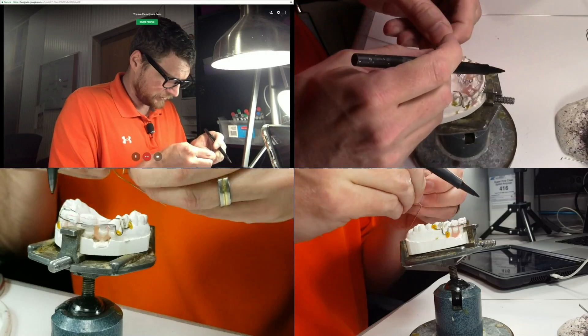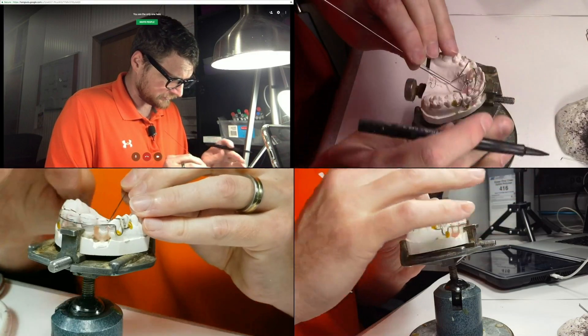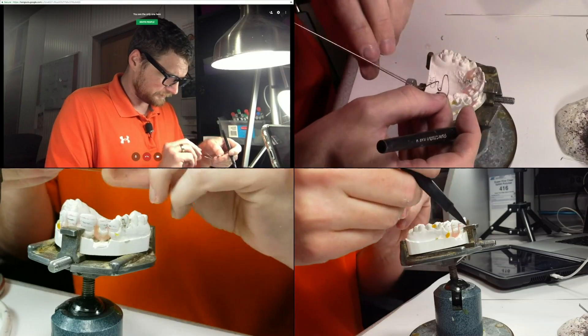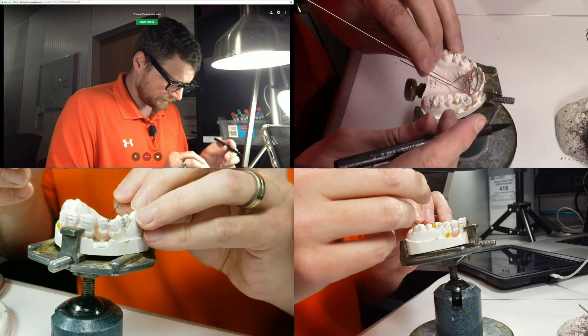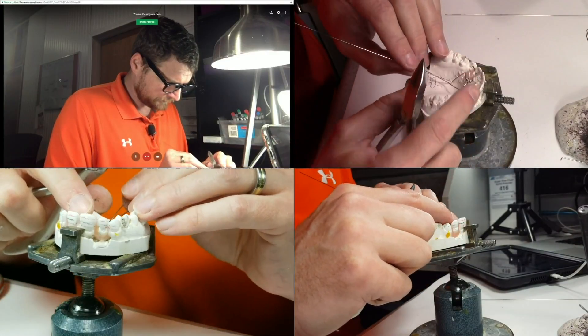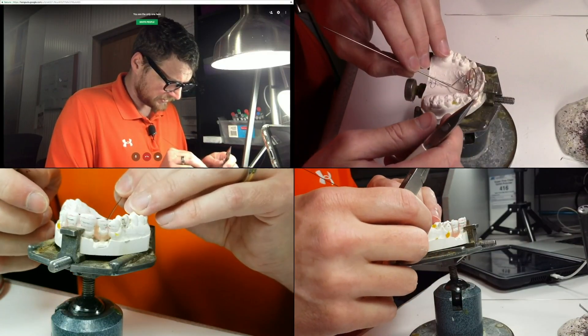I usually don't try to capture the distal of the twos like I have here, but since we're really going to be pushing those twos out, I really need to get them — and I just knocked off the labial bow, so I've got to be careful with that.